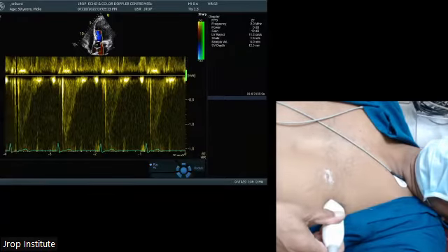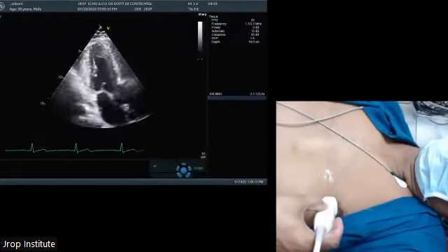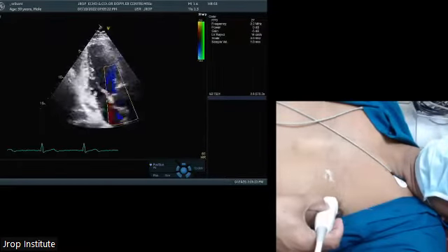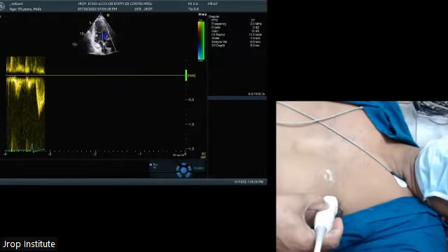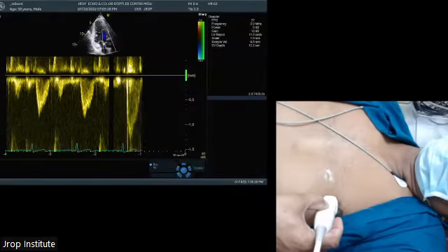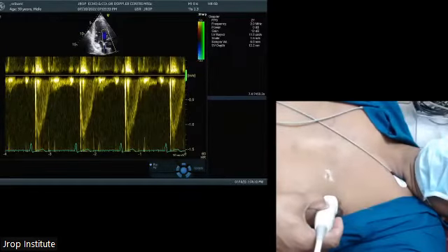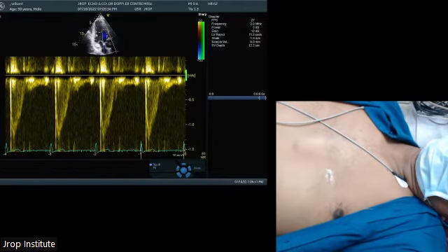So we look at the aortic valve, we look at the mitral valve. We also look at the aortic valve in the 3-chamber view. Same, switch on colors, pulse wave at LVOT, then move to the aorta. This is aortic flow. So the apical window is useful for flow measurements in the mitral and aortic valve and to look for wall thickening abnormalities.